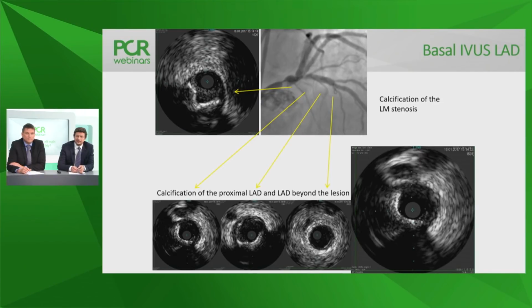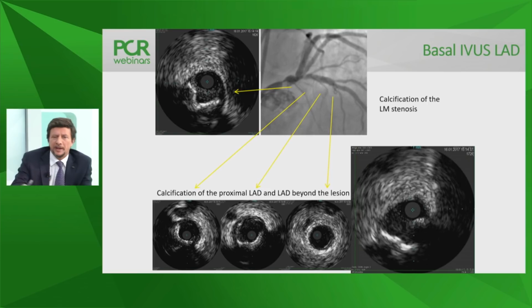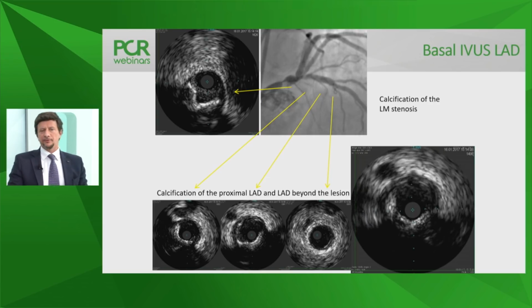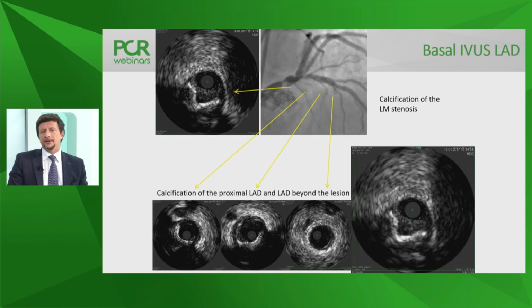I think that you performed IVUS in this case, and by the way, IVUS will also help us to address a couple of questions that came from the colleague, but we'll come back to this in a while. So, can you comment on this image? Yes, well, to my surprise, the IVUS probe went through the left main stenosis to the LAD, and what you see on the bottom right part of the screen is the pullback from the LAD to the left main. We have saved some still frames to show you some of the specific questions that we want to answer with the IVUS.